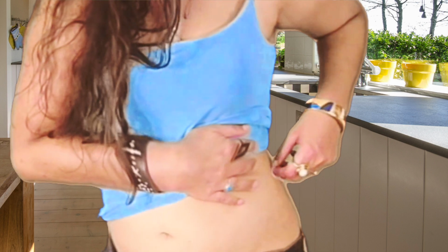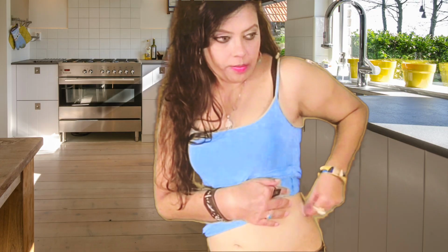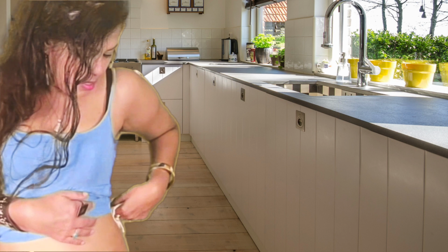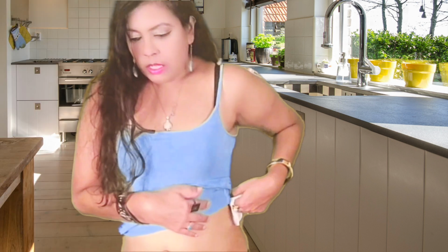Okay, so I think I'm comfortable with the spot. So just one spot. My pod is beeping because it's getting impatient. Did you guys hear that? Well, so now I have applied the wipe here. Important for you to wait until the area is dry, okay, so that it sticks, and it has to stick well, and you need to get a good 3 days. Okay, so here I have a napkin to wipe it with. So now I've ensured that this is dry, okay?